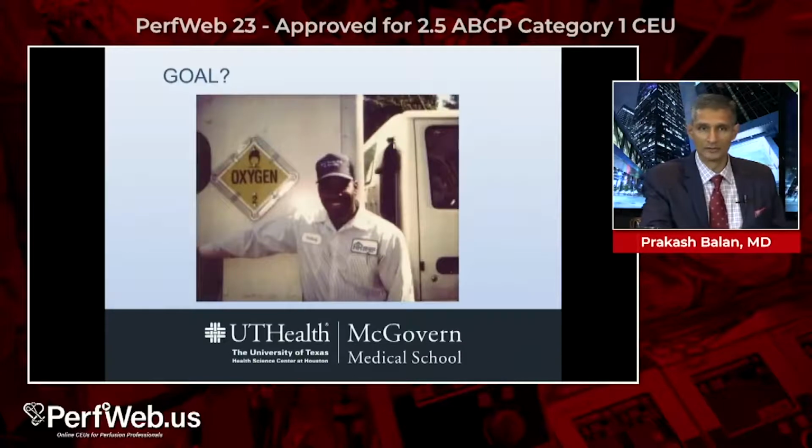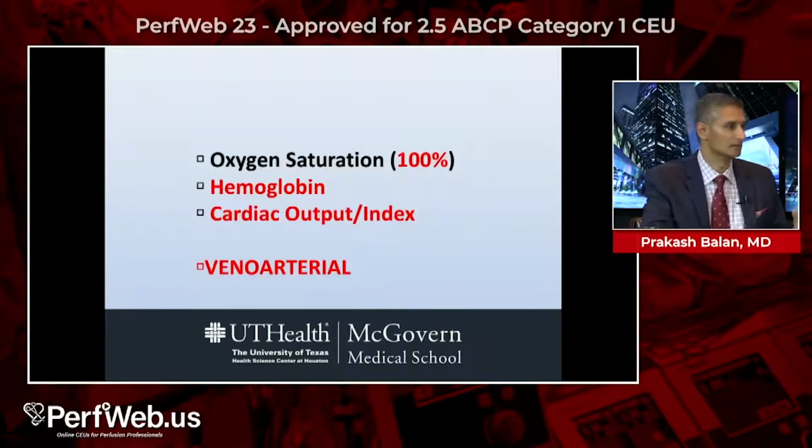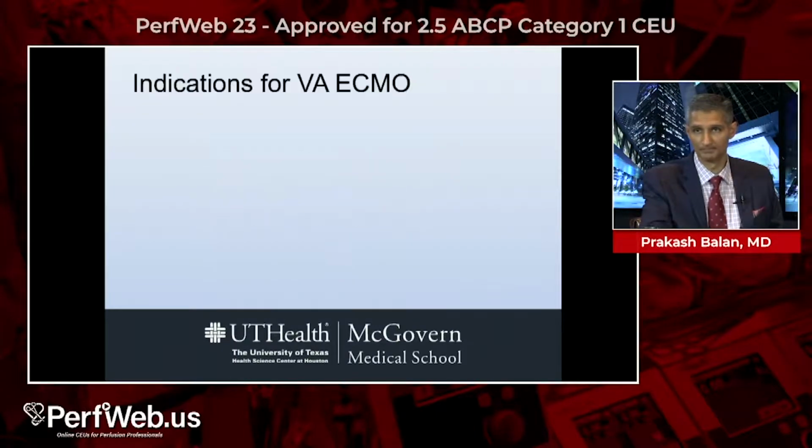The goal of this therapy is oxygen delivery. It's all about getting blood, i.e. the oxygen carrying capacity of hemoglobin, circulating, getting an oxygen saturation that is up there at 100%, and using flow, cardiac output, and flow from the circuit to deliver that oxygen to the patient.